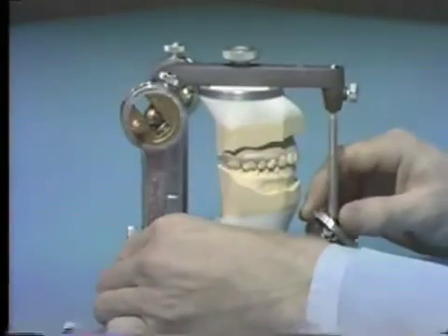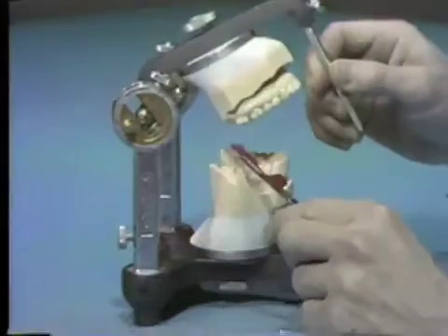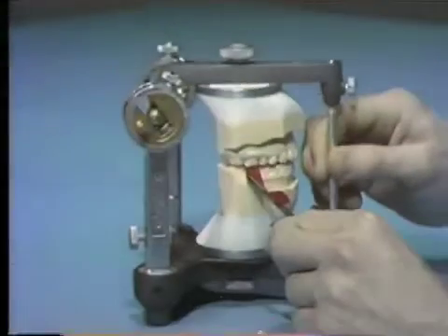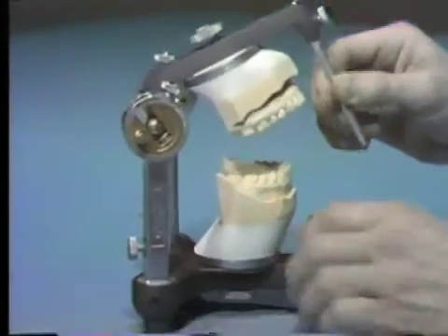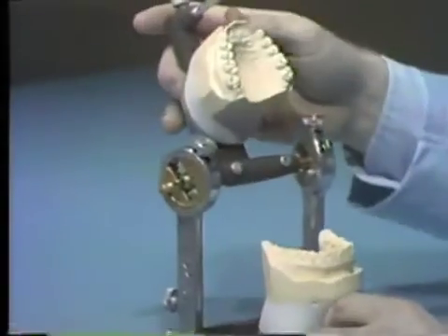All the centric stops should be marked with articulating paper. For purposes of demonstration, only the maxillary first molar centric stops will be marked with articulating paper. Centric occlusion contacts on the cast may not be exactly the same as those observed in the patient's mouth. The differences are explained in part by mounting errors. Hand articulating the cast in centric should result in a close approximation of the patient's centric occlusion, even though it will not be exactly the same.